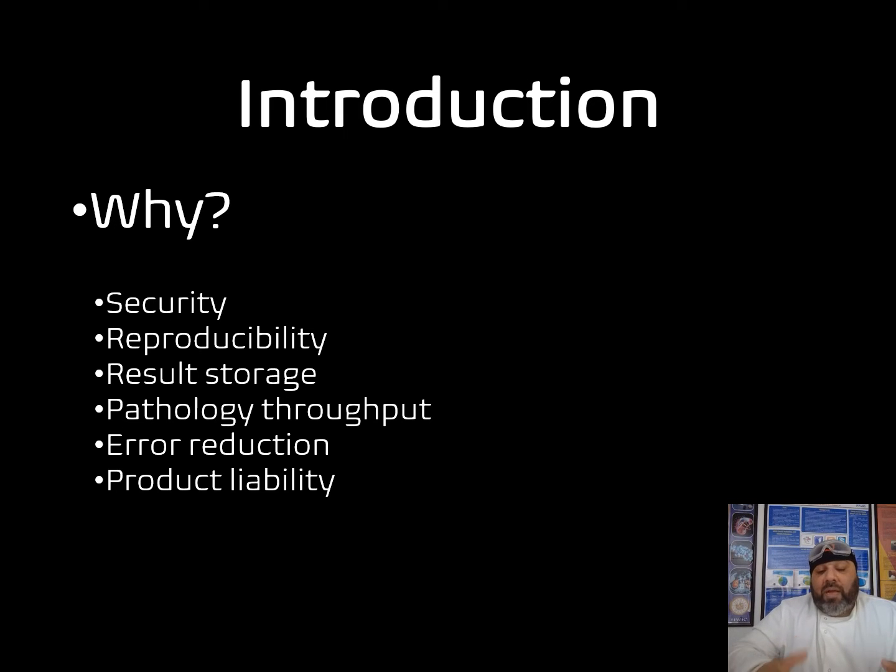The security aspects of pathology medicine and in relating to pathology automation have advanced, so that investigations that are performed through automation are more secure on various fronts. And then aligned to this is the reproducibility.